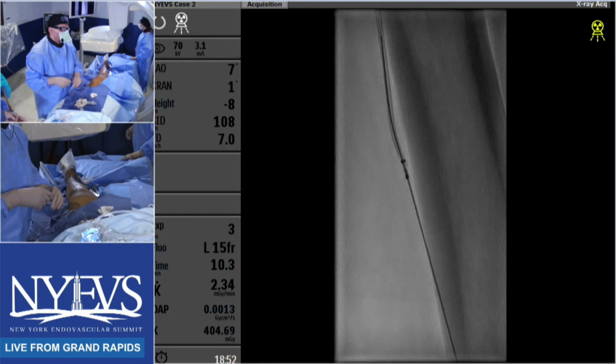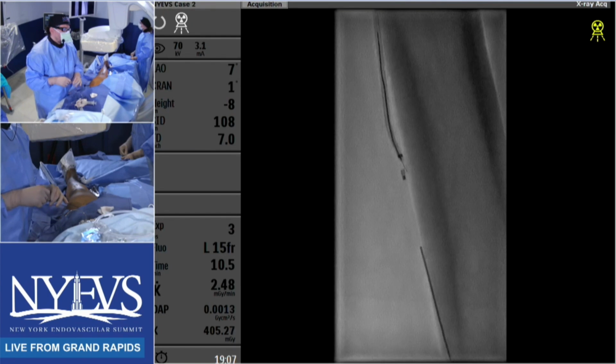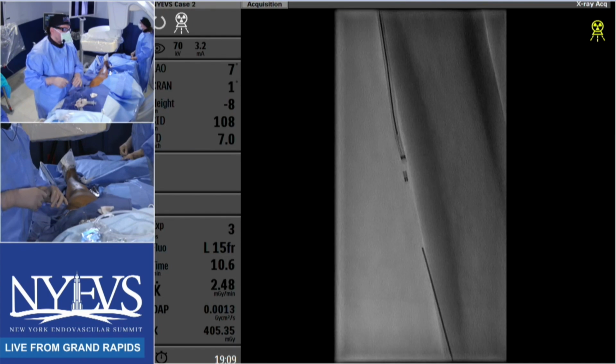So with something like this, let's say once he's through, he balloons it. Are we going to throw stents all the way up and have a beautiful angiographic result at the end of it that is not going to last long enough for that wound to heal? That's where the argument comes in about surgical options versus endo. Even with the inflow, to your point about laser atherectomy, agreed, that's the same way I do it as well. But that is a really long stent.